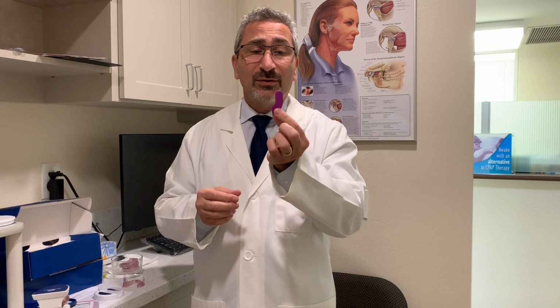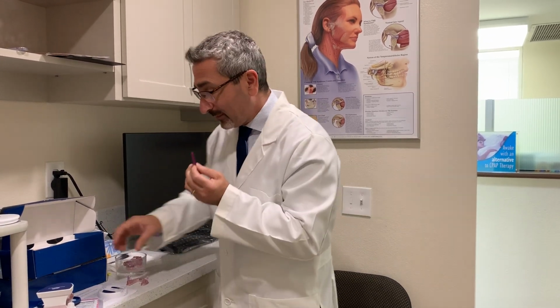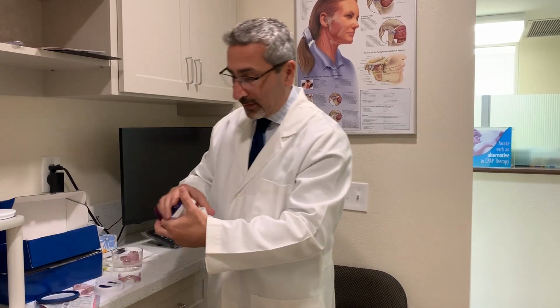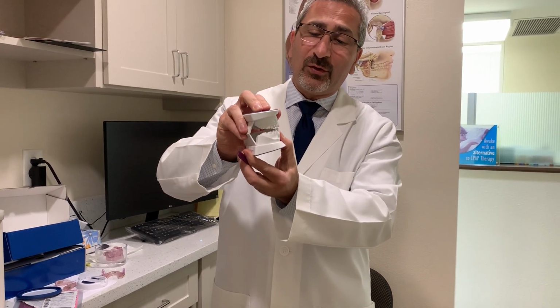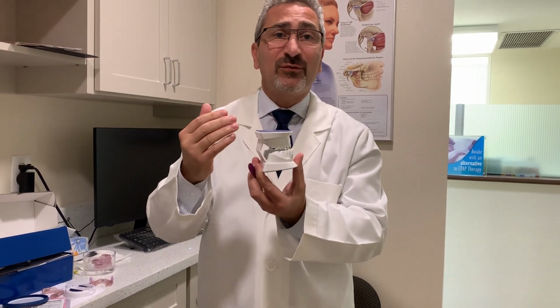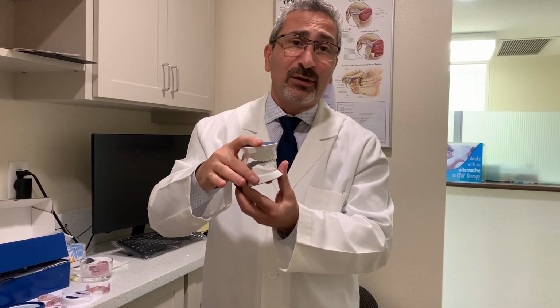So after 30 minutes of letting your jaw relax and letting your teeth slowly settle into place, you're gonna take this piece, you're gonna use the long end, put it at your front teeth. I will do it on this model. What you're gonna do is, this is your normal bite. With the mouthpiece opening the bite, bringing the jaw forward, your jaw may like that more stretched forward position and more relaxed muscle, but I want to keep your bite where it is.